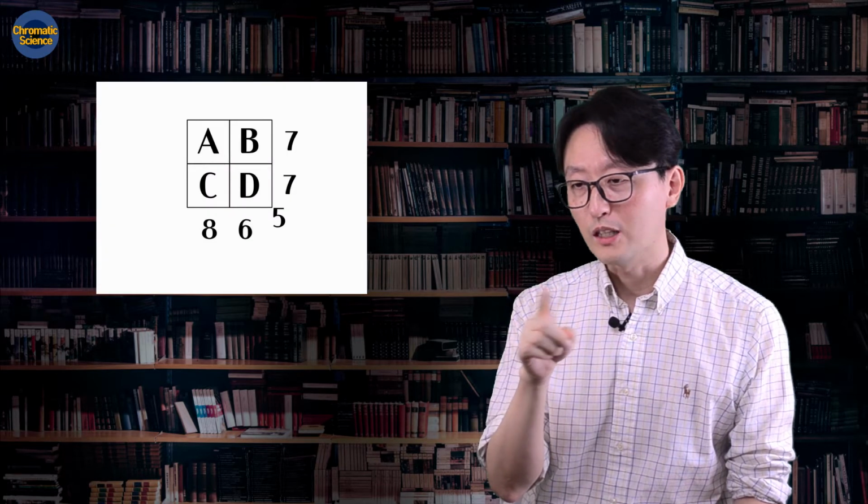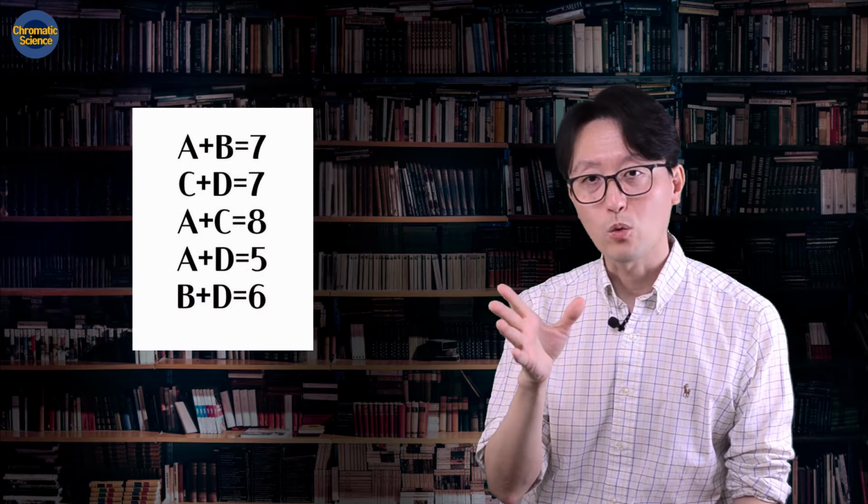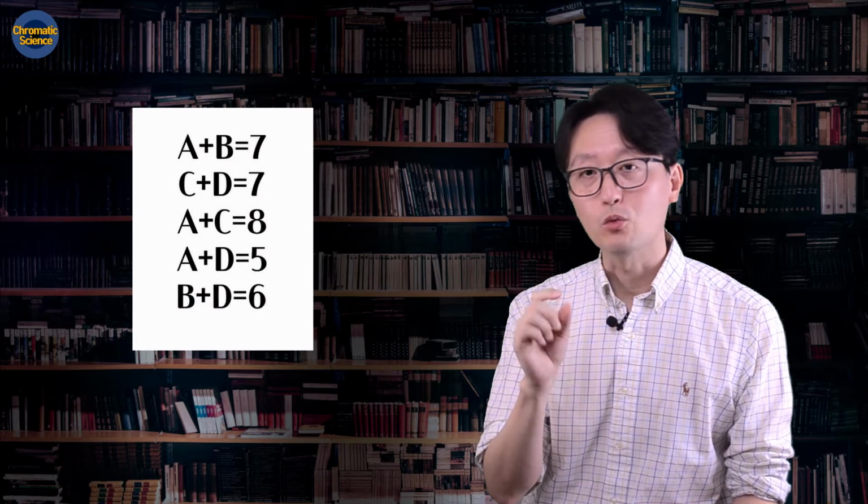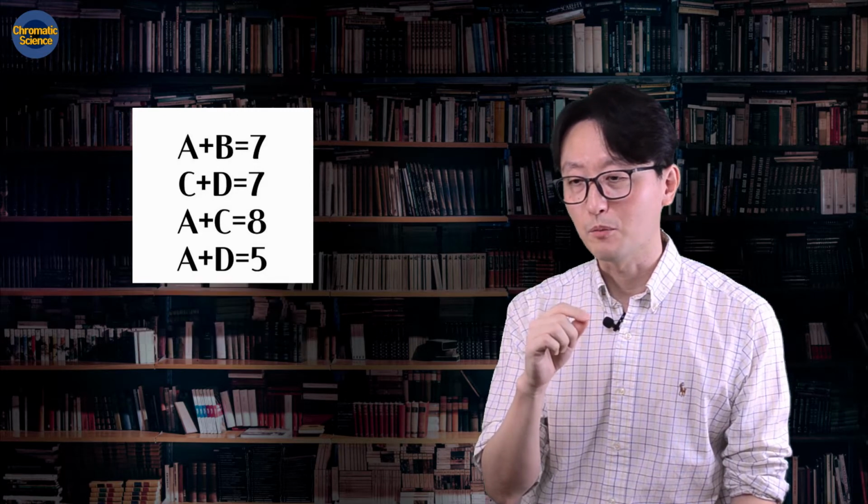First of all, let's finalize the mathematical problem that I gave you. If you write down all the constraints as equations, then you're going to have 5 equations, and one of them is redundant, so you can use only 4 of them to solve this mathematical problem.